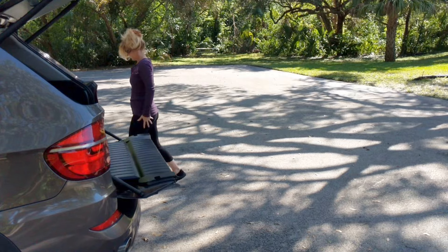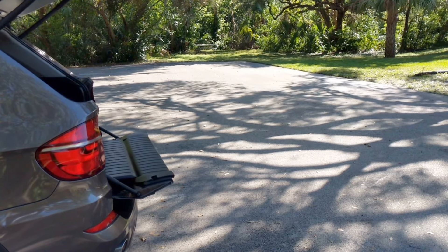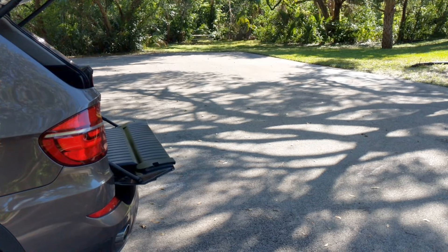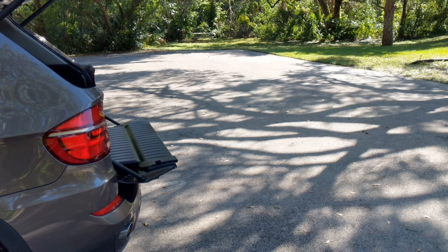There you go folks — an unedited look at the Airhawk. We do not make Hollywood into our videos. We tell you the truth and we use no editing. There you go folks, the Airhawk Power Folding Wheelchair.